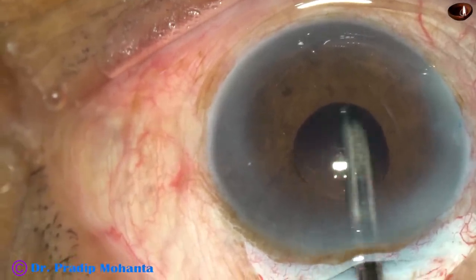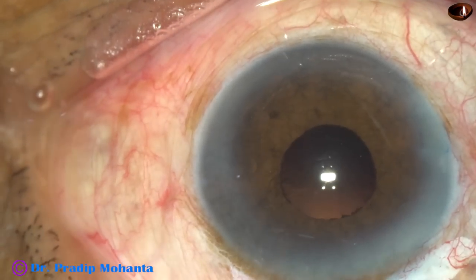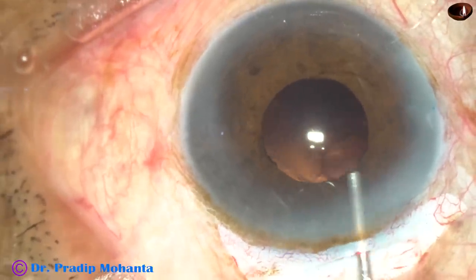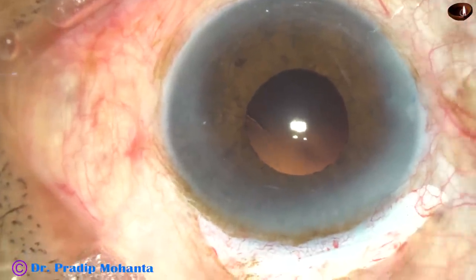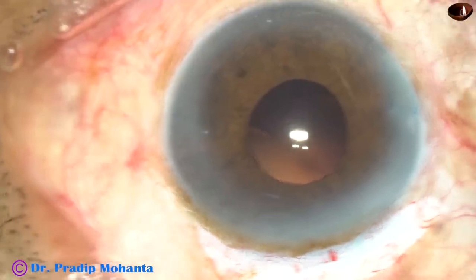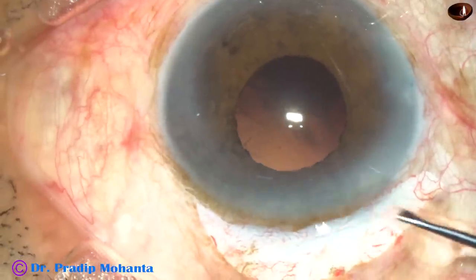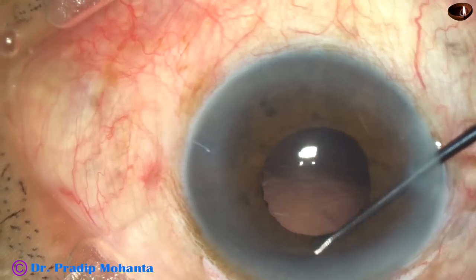There is some cortex at 7 o'clock. To remove it, go through the main incision — inject viscoelastic substance to fill the anterior chamber first. The visco comes out gradually, keeping the chamber formed while you remove the cortical matter. Cortex at 7 o'clock and 6 o'clock has come out. Inject visco and use a Y-shaped instrument to check if cortex remains all around. The Y-shaped instrument is very good for retracting the iris and inspecting for residual cortex. Cortical cleanup is complete.